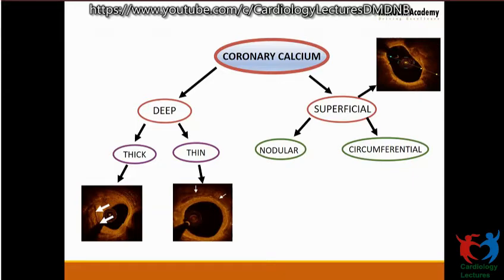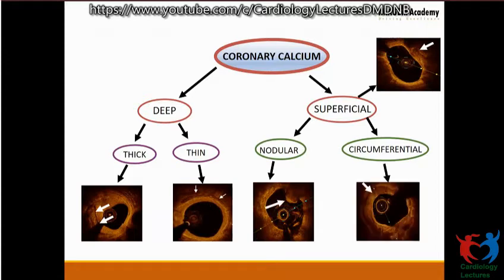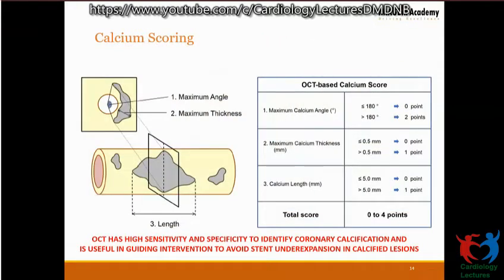It's the superficial calcium which troubles. If you have superficial thin plate calcium, there is nothing to worry about, and you can easily deal with it. But if you have nodular calcium, superficial nodular calcium, then it is trouble. And if it is circumferential, then the problem is more, because in that case you need to have some debulking strategy with you. When you have superficial, deep, or nodular calcium, you need to have some debulking in place. We also use calcium scoring. I will not go into the details of this.